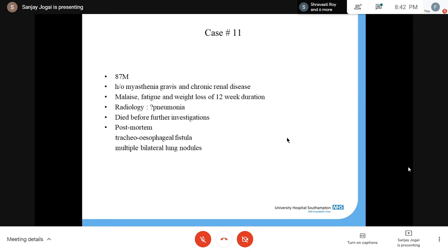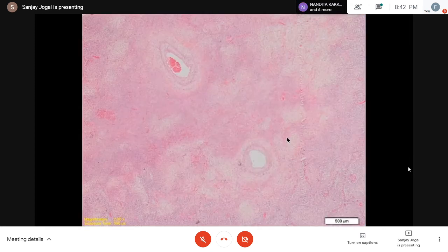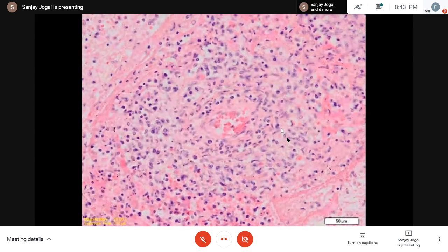but said, okay, I need to sample some lung tissue because we want to make sure what's going on, are we right? And lo and behold, as soon as he saw sections with a dense lymphoid proliferation, he said, Sanjay, can you handle this? Because I do GI pathology, I have no idea about lymphomas. Now I got very excited because even on a scanner you can see these very infarct-like areas and these vessels standing out. When you go up close, look at that.